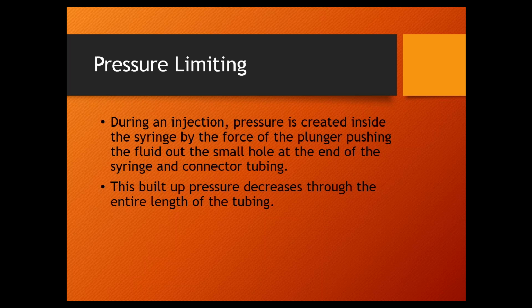Now, whenever there is an injection that takes place, we have this connected to the patient, and this is shoving fluid out. There is a very long, thin tubing here that the fluid also has to get shoved through. And then once we get to the patient, it goes into a little IV needle, which is either a 22, 23, 24 gauge needle, if not smaller. So an even smaller opening. We're trying to shove fluid out of this syringe through a really tiny little IV needle. There's going to be a lot of pressure built up behind it.